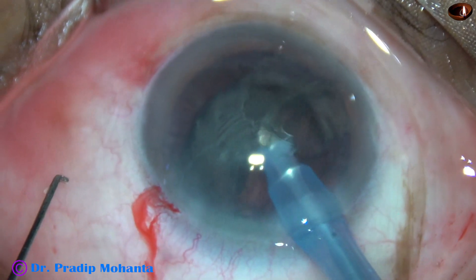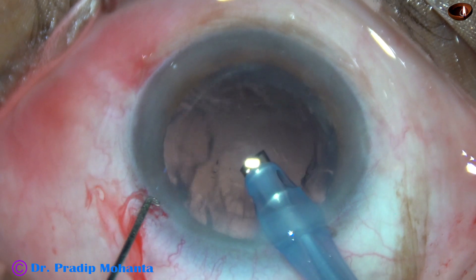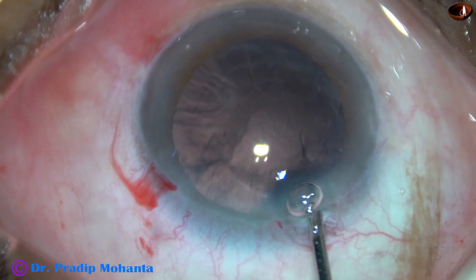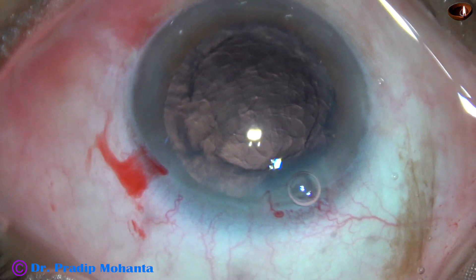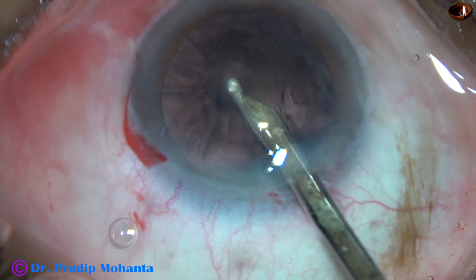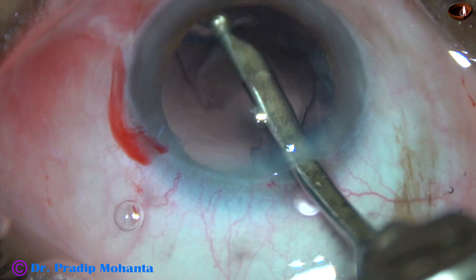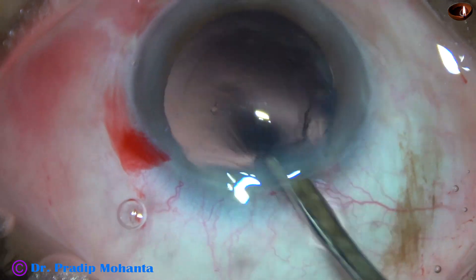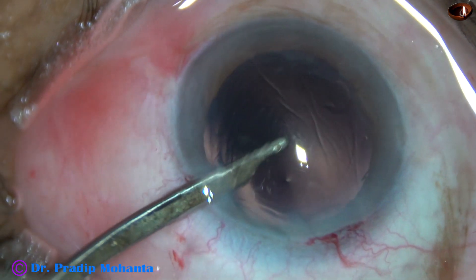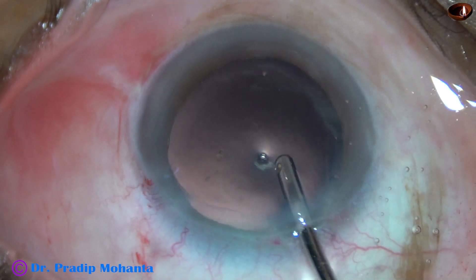This is the epinucleus. At this time, stability of the anterior chamber should be more, so I have removed the chopper. Some viscoelastic is injected in the anterior chamber. There is only one side port, so either we have to use a coaxial IA or this 23G Simcoe cannula. An advantage of this instrument is it goes through the side port and we can remove the sub-incisional cortex very easily. When using coaxial IA, sometimes we have difficulty removing the sub-incisional cortex.